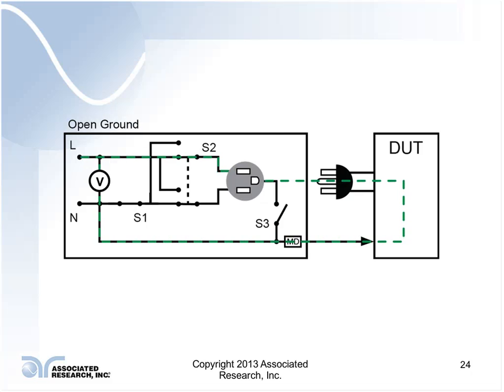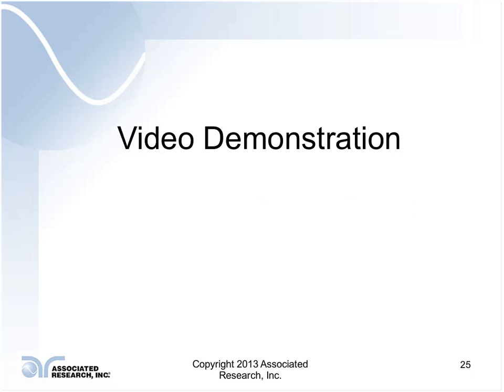Like I said before, I like to cover all 8 scenarios. I don't see it fluctuate much when I do open ground and open neutral, but in certain cases you can see it rise just a little bit. So this gives you an idea of what's happening, and that's important for when we start some of these videos.